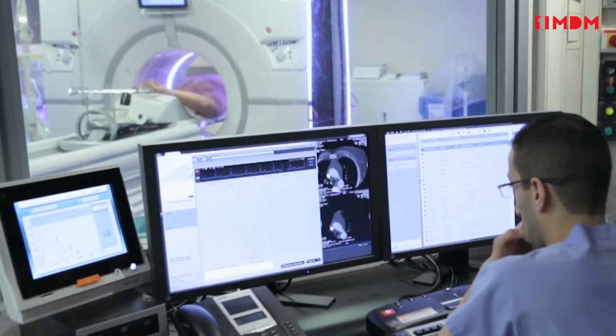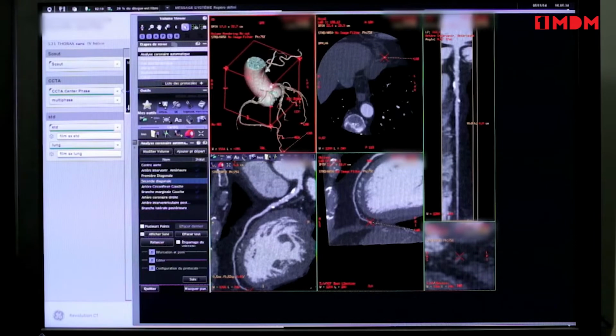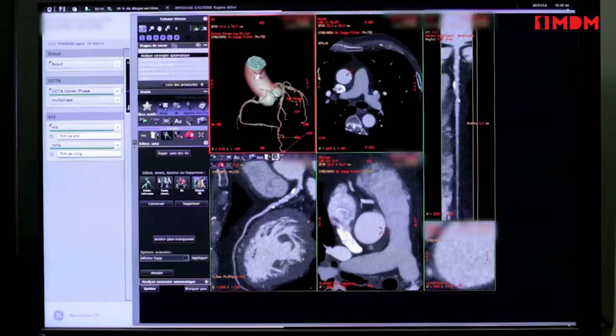The Clarity operator environment supports you with instantaneous access to images as they reconstruct, and by automatically pushing them to viewing stations for your review. You can also post-process the images directly on the Clarity operator environment without interrupting your patient workflow, thanks to the multiple session capabilities.